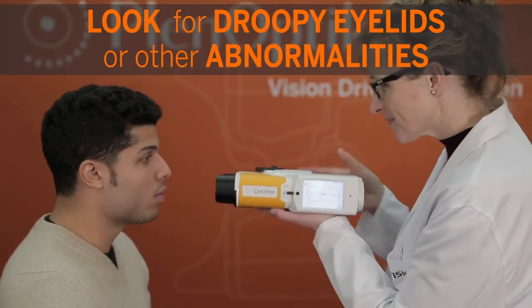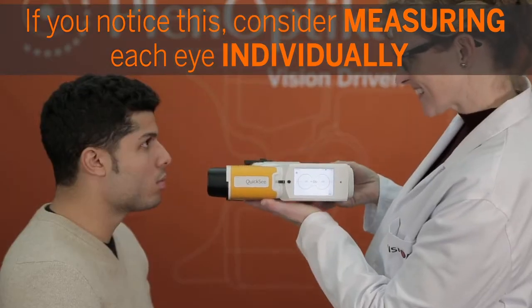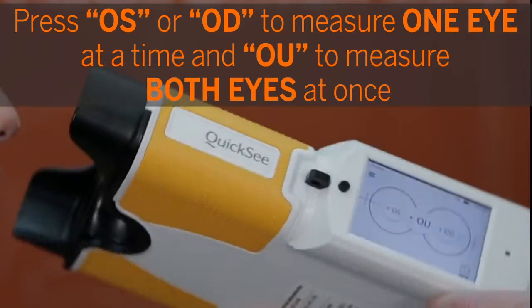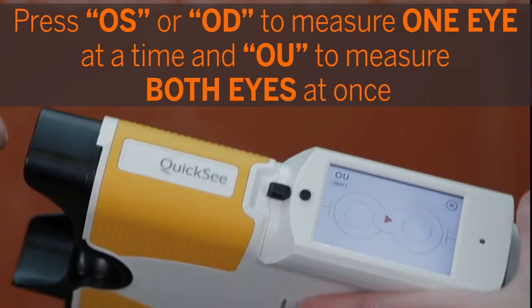Look for droopy eyelids or other abnormalities. If you notice this, consider measuring each eye individually in order to make the alignment process easier. Press OS or OD to measure one eye at a time, and OU to measure both eyes at once.